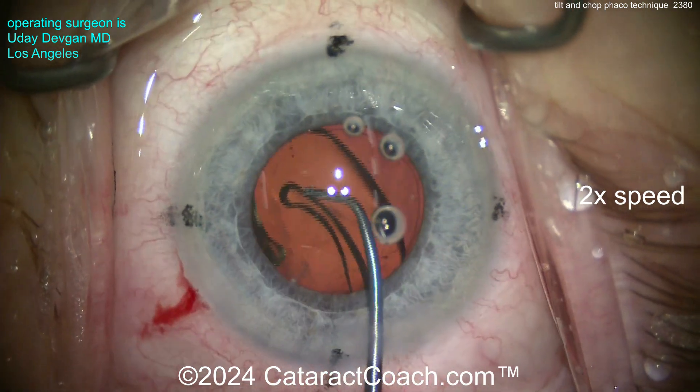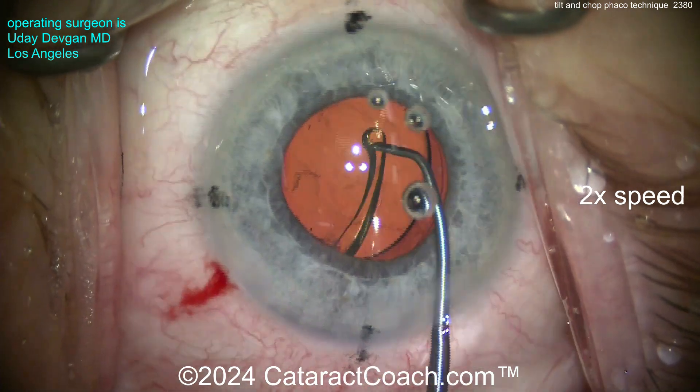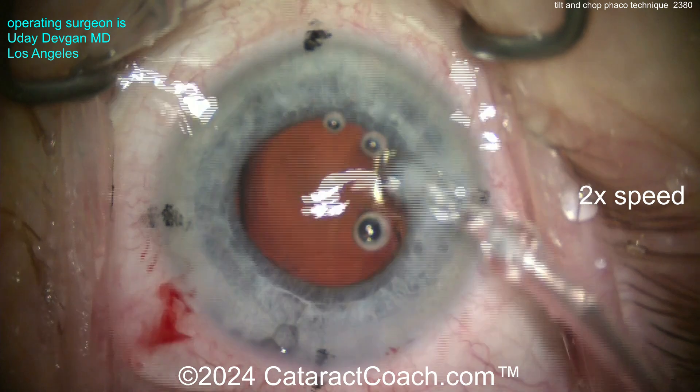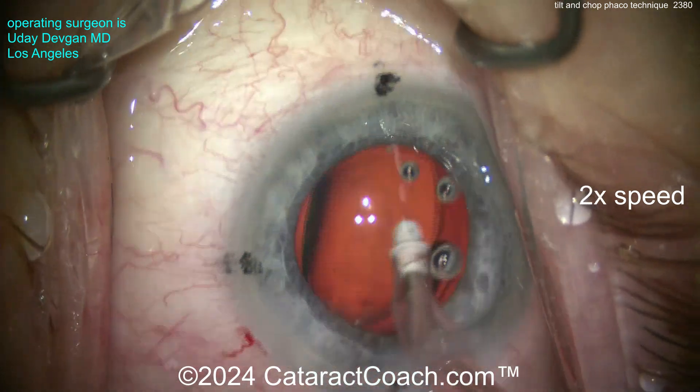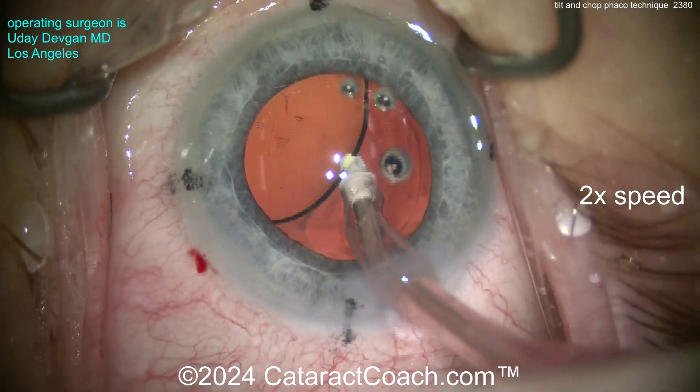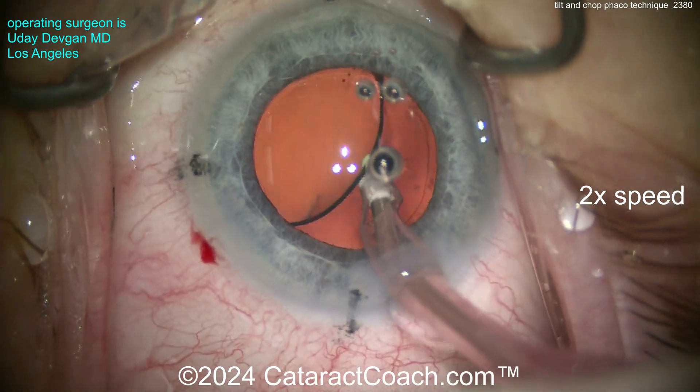Here comes the lens — looks like a toric monofocal lens going into the capsule bag. We'll get that positioned, and you'll see at the end that this is a six millimeter optic and the rhexis will overlap for a full 360 degrees. Nicely done rhexis.